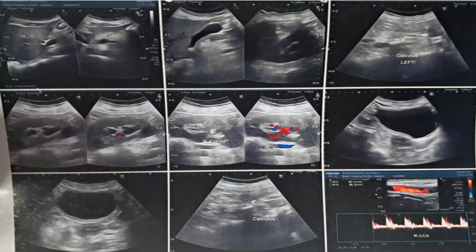Now this is the ultrasonography. Yes, Sachin, can you read? Yes, sir. This is ultrasonography of the kidney, ureter, bladder, and upper film showing the liver, and the right kidney showing moderate hydronephrosis, and some central echogenicity is there, and a hypervascular lesion can be noted in the center of the right kidney, the mid pole.